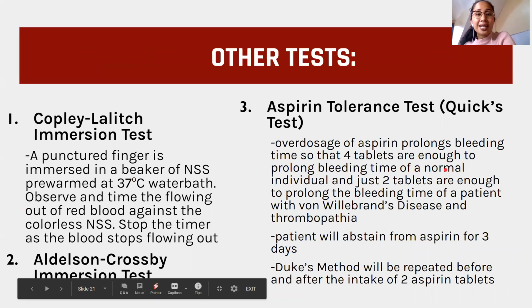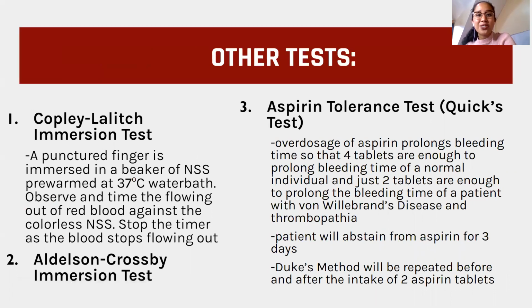So other tests, class, these are historical tests of your bleeding time. We have the Copley-Lalich immersion test. A punctured finger is immersed in a beaker of pre-warmed NSS. Observe and time the flow of red blood against the colorless NSS until it stops. Stop the timer as the blood stops flowing out.